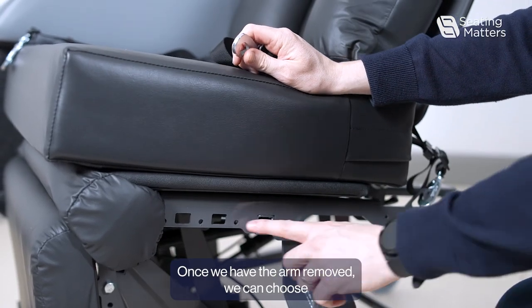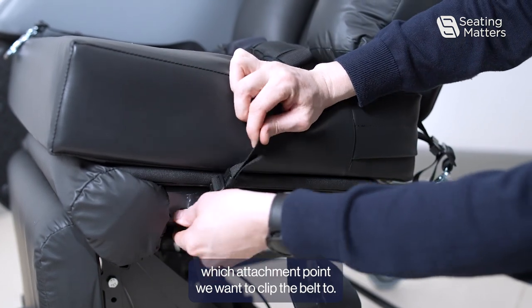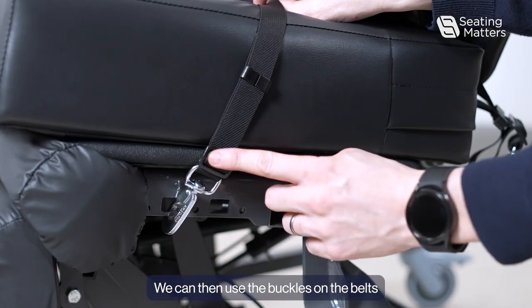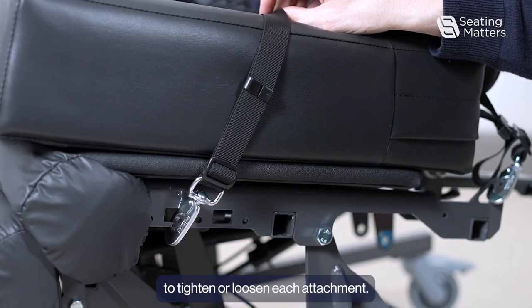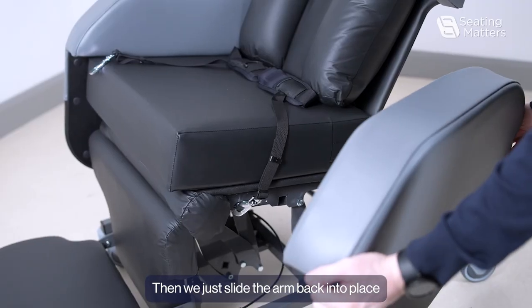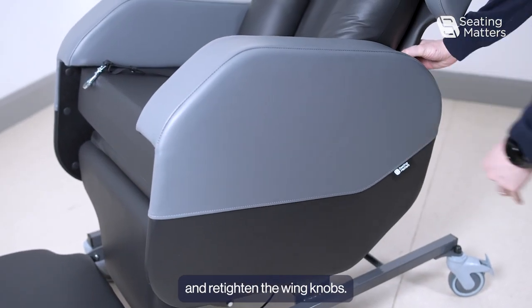Once we have the arm removed, we can choose which attachment point we want to clip the belt to. Each one will give us a slightly different angle. We can then use the buckles on the belts to tighten or loosen each attachment. We can then repeat that on both sides.